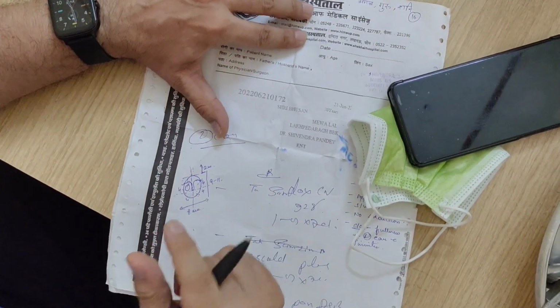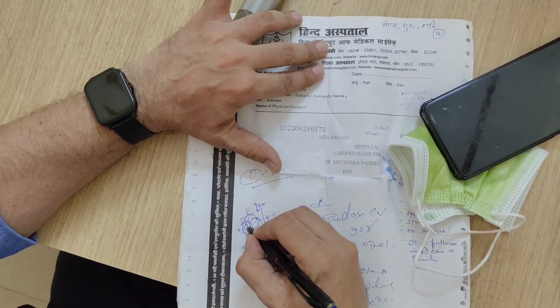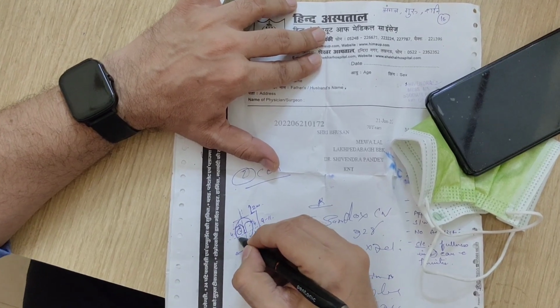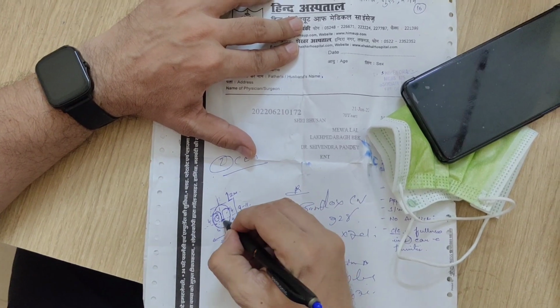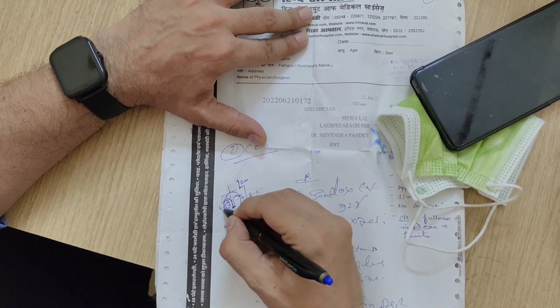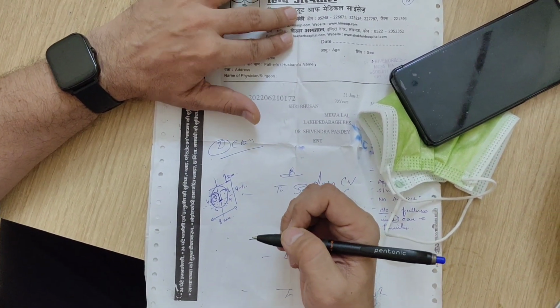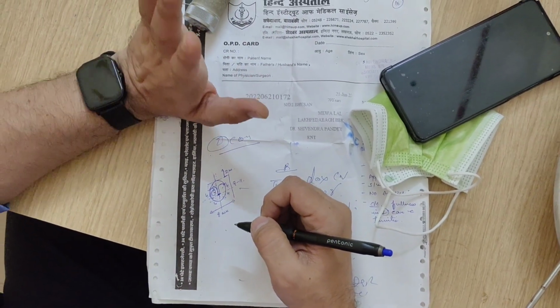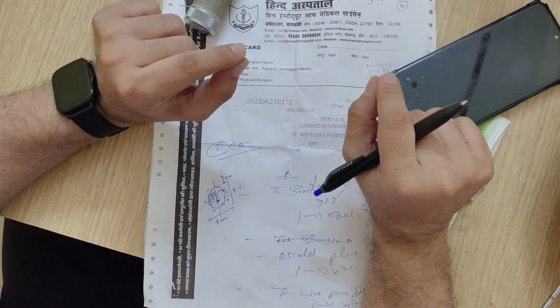So when you look, you have to see where exactly it is. It is in the antero-superior quadrant, and it is lying well within the levels of the tip of the handle of Malleus, that is the umbo, and the malleolar fold. So this is within the size of 4 and 4. So this becomes approximately 3 millimeter by maybe 3 millimeter size perforation. That's how you give an approximate idea how big is the perforation. Otherwise, you are not measuring it with anything.